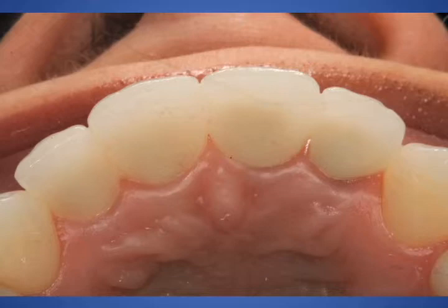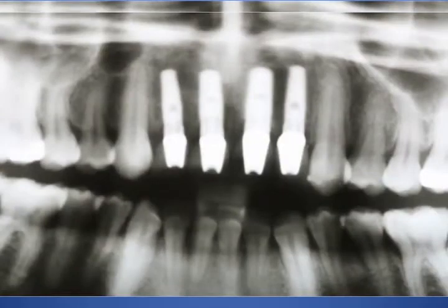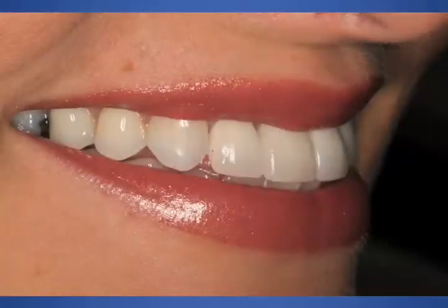An occlusal view of the same. These are 4 individual zirconia crowns. Final radiograph shows nice positioning, nice separation of the implants. We're not impinging on the natural teeth. And this was all predetermined using the CAT scan or the CT scan to diagnose and surgically place the implants. Virtually placing the implants in this situation gave us a tremendous advantage over freehanding this case.